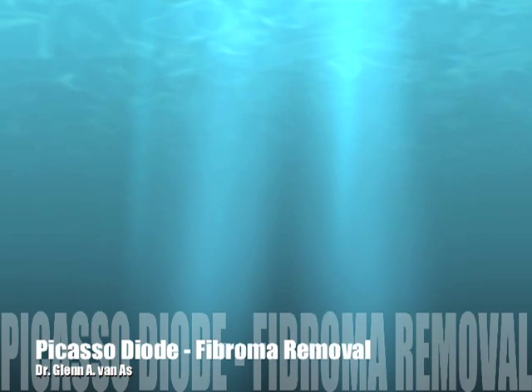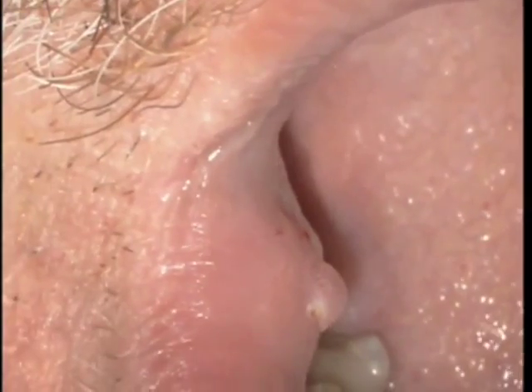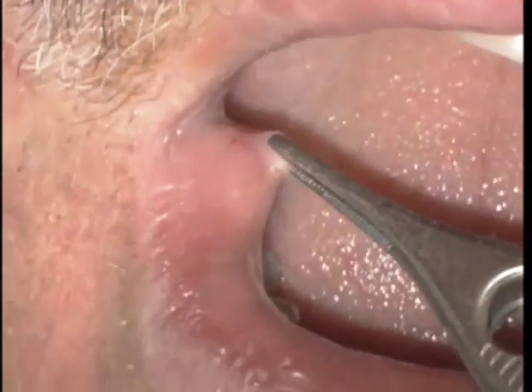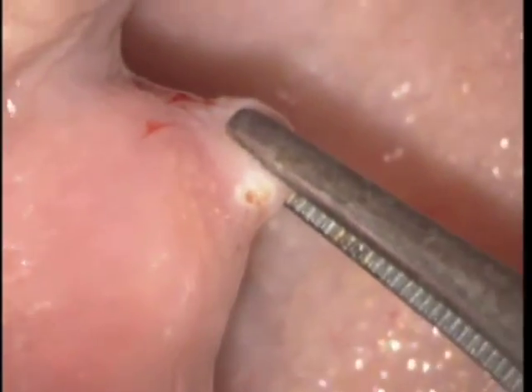In this video we're going to see how the Picasso diode from AMD Lasers is able to remove fibroma. This fibroma was on the right buccal mucosa. You can see in this video, shot through an operating microscope, that we're using pickup tweezers to distend the fibroma. There it is at low magnification of about 2 power and up to about 8 power.